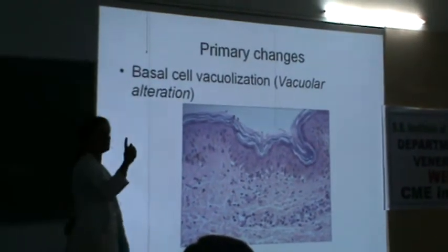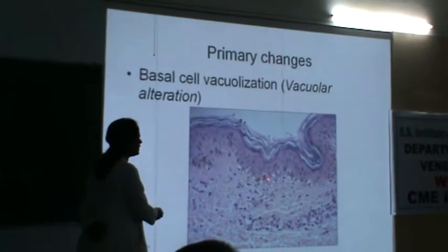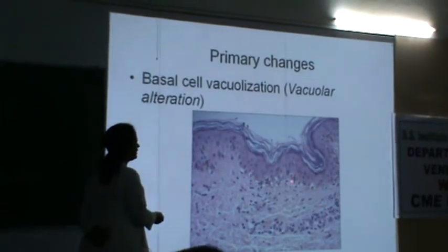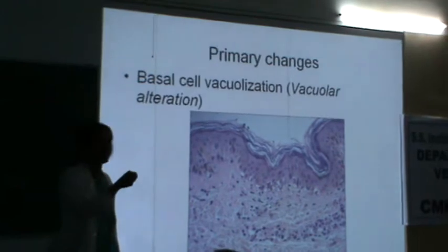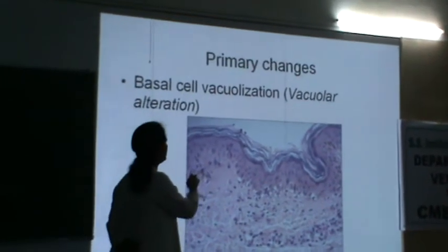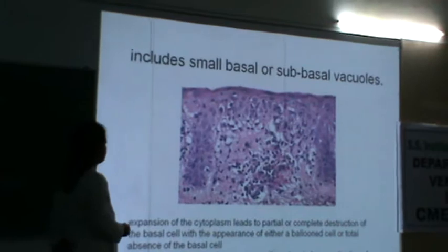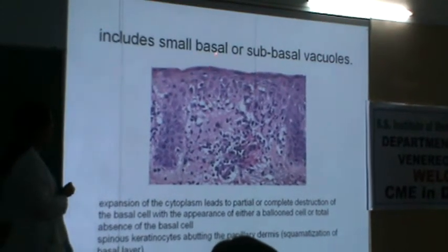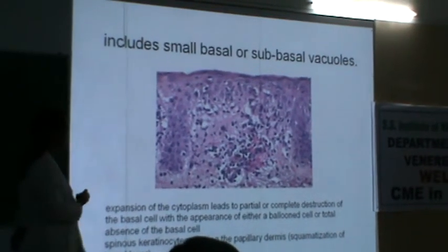Looking at the primary changes: where the basement membrane was seen with a special stain, now you can see the basement membrane has been replaced by spaces — vacuoles. The first thing is basal cell vacuolization — the vacuolar alteration. Vacuolization includes presence of vacuoles in the cells, which could be basal or subbasal. If you see the cells here, the vacuoles are present, the nucleus is up — this is subbasal and basal vacuolization. This vacuolar degeneration leads to destruction of the basal layer.